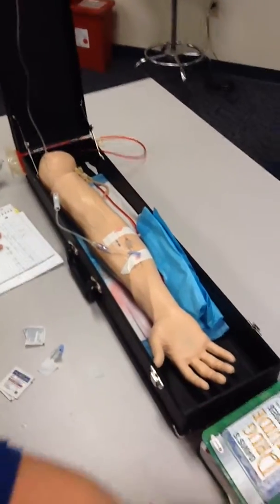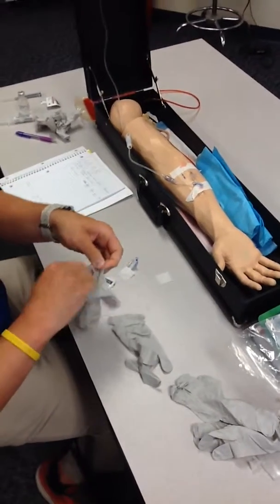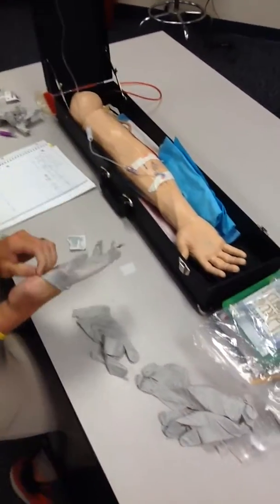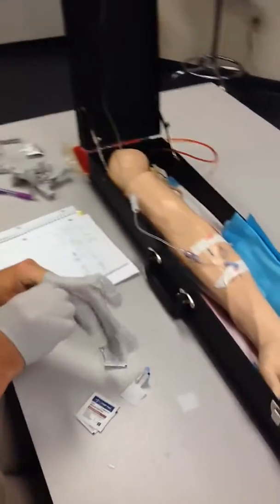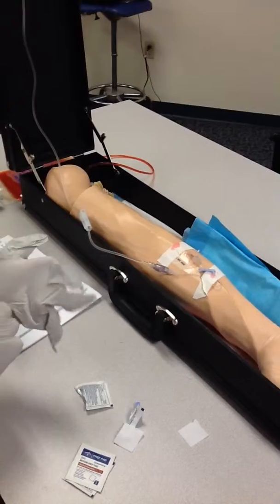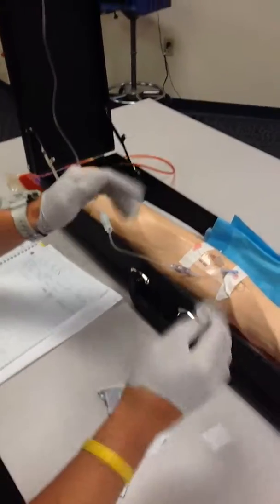I will reapply gloves. I'll try to talk to the patient while I'm doing this to make sure he knows what's going on with the situation, that the drug is treating the infection, in case he wasn't sure before. I'll come in.